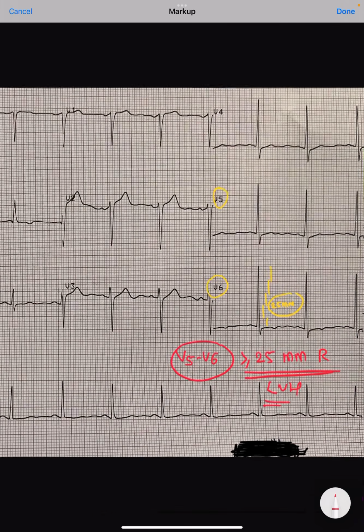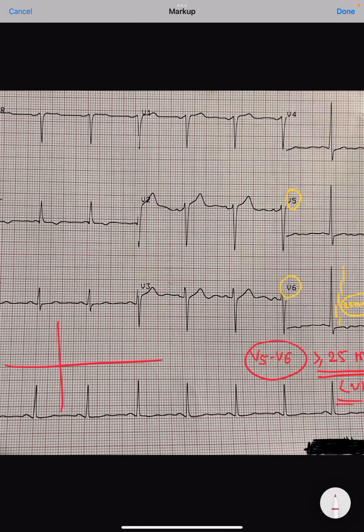And why is that so? We must know, this is the x-axis, this is the y-axis. Our heart, we have these two nipples here. So the heart is usually present in this side or this area. So the maximum portion of the left ventricle is around the left side.